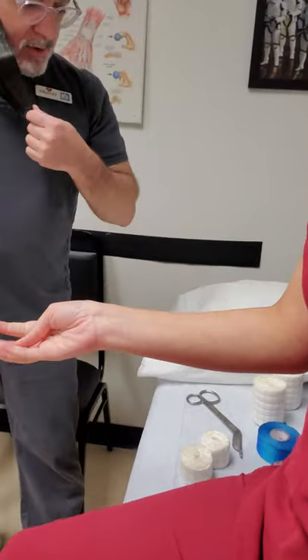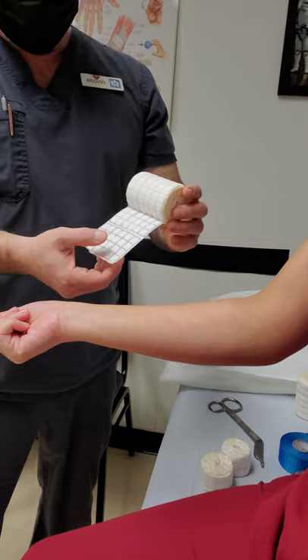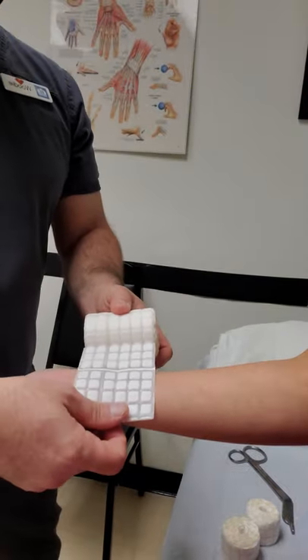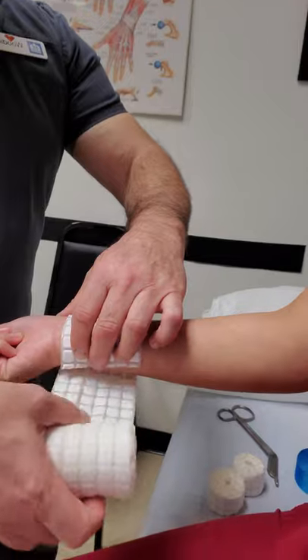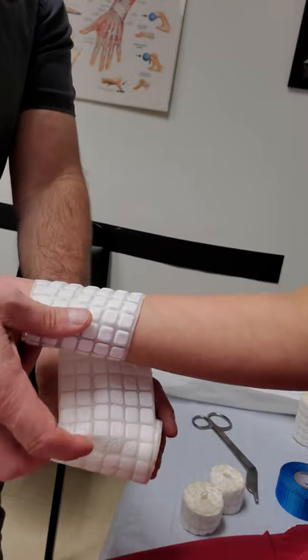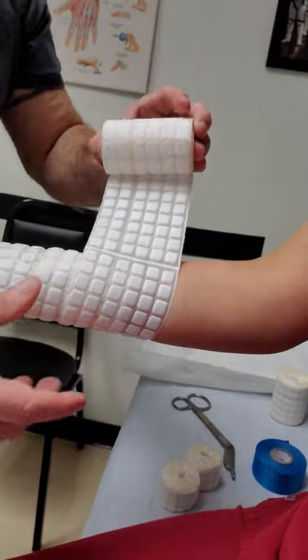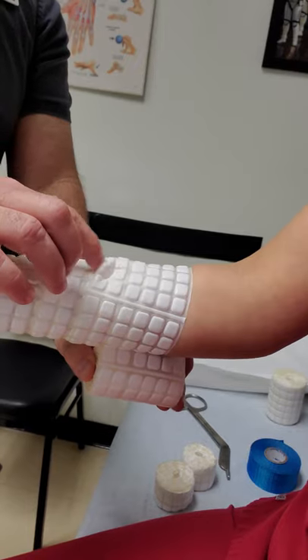So what we're going to do, we're going to start with some pretty basic stuff. The polyurethane Gore-Tex looks, sounds, and feels like bubble wrap. It has two surfaces: a sticky side and a smooth side. The smooth side goes against the skin — the sticky side helps each turn adhere to itself. You overlap it halfway every time; you don't have to pull it super tight. Unlike cotton, there will be some ripples along the way, and that's okay as long as you overlap halfway every time.